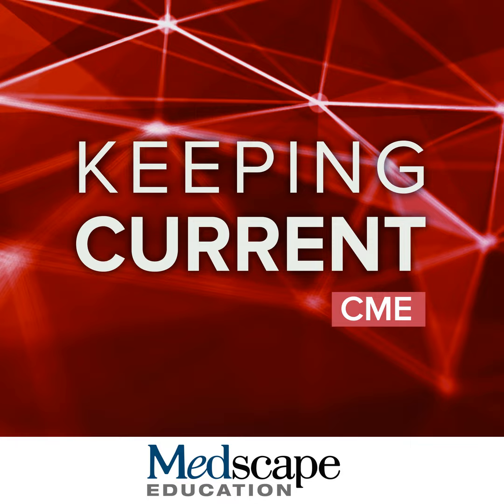Just an example of what we will see. So we see this subcentimeter nodule. It does not have arterial phase hyperenhancement. It is clearly seen as a hypoenhancing focus on 20-minute hepatobiliary phase. And in this case, 8 months later, you can see the lesion is larger. It has clear arterial phase hyperenhancement. It has washout. It has hepatobiliary phase hypointensity. And this is LI-RADS 5, definite HCC, can be diagnosed without biopsy.